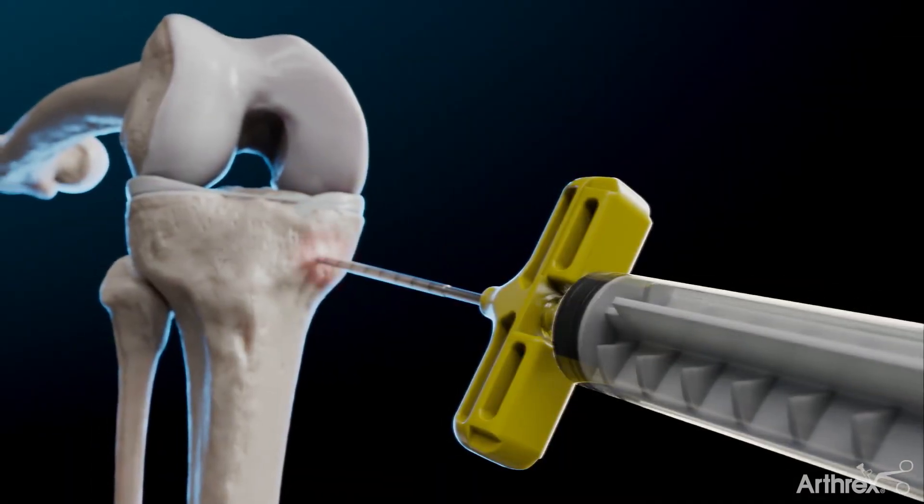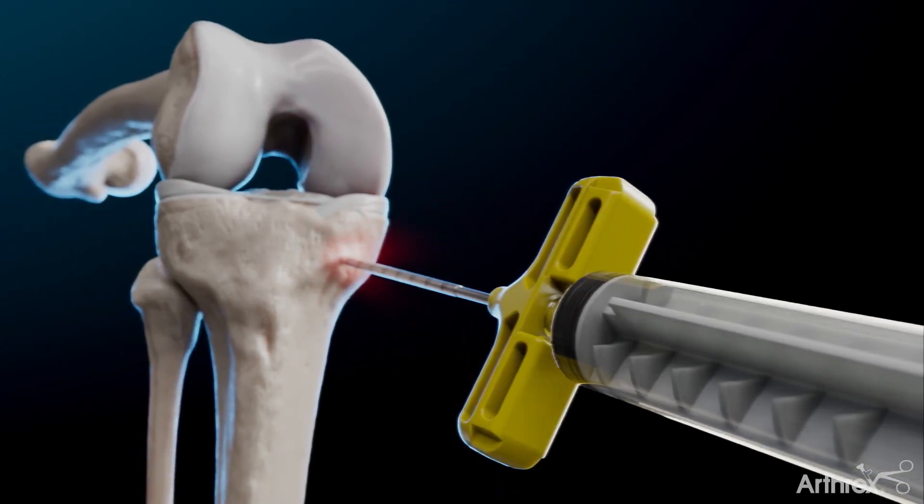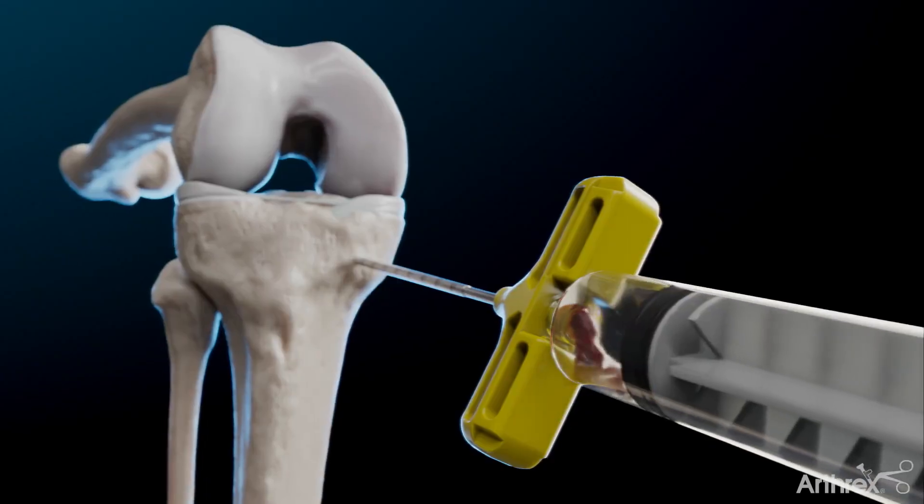Begin by performing a bone marrow aspiration from the proximal tibia, which will be processed using the ANGEL system.